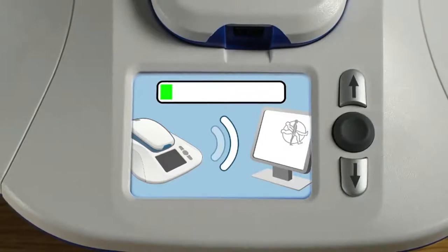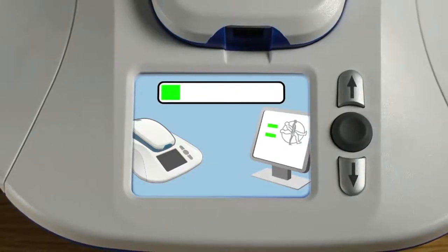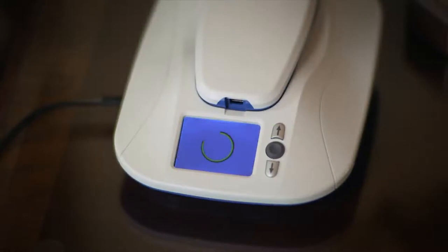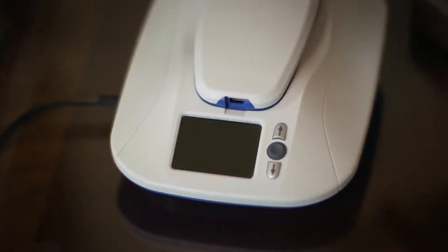Now the screen will show the MyCareLink monitor sending the data to a secure location that your doctor can access. A green check mark will appear when the process is complete. When the large green check mark disappears, a smaller check mark and your last transmission date will be displayed in the lower part of your screen for about five minutes. It's normal for the screen to go dark at that point to save energy. From this point on, the transmissions will happen automatically. You should avoid pushing buttons on your MyCareLink monitor unless instructed by your doctor.